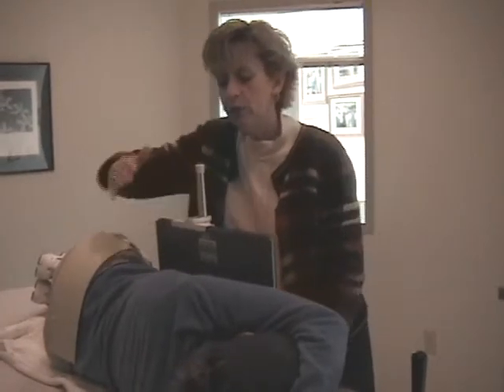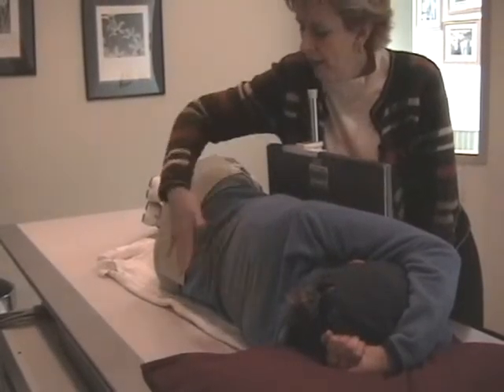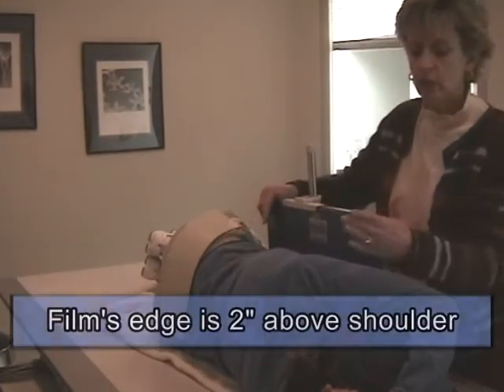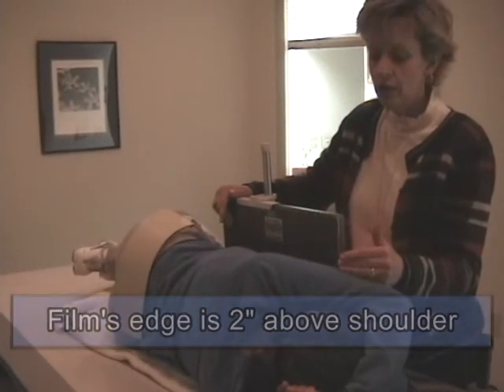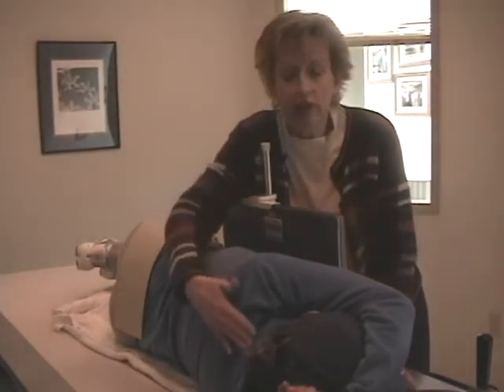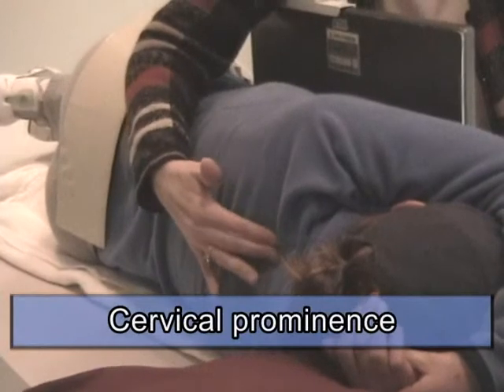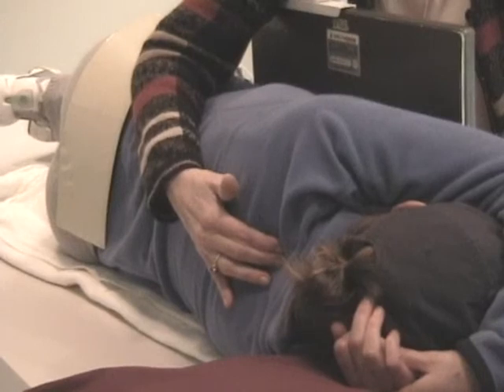Patients in a true lateral position, you need to validate that she is by feeling the shoulder blades and the small of her waist to make sure she is in a lateral position. The film's edge is 2 inches above her shoulder. It's difficult to tell that positioning the patient or perhaps to visualize it on the camera. So here's the trick that you use to position the patient. You feel for the cervical prominence, the most prominent point of the cervical spine region. That's C7. They call it the cervical prominence.